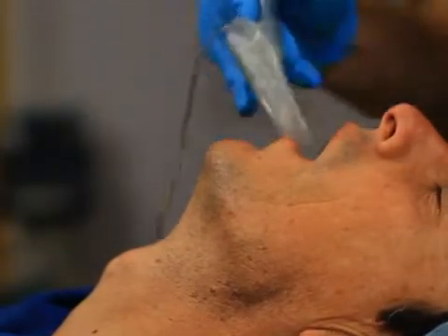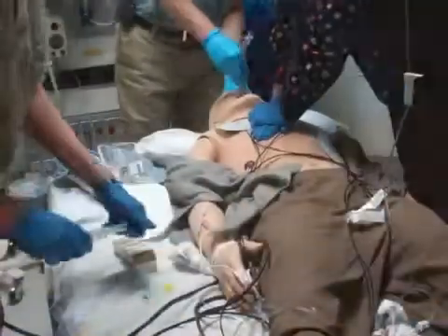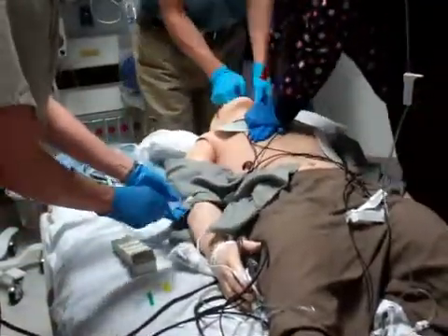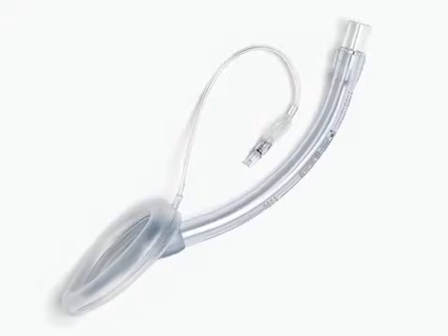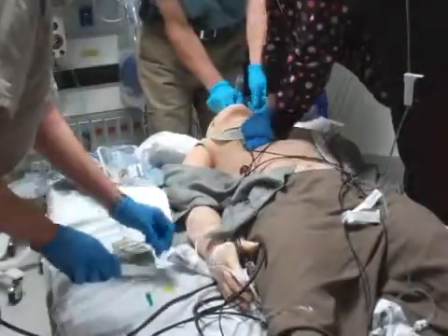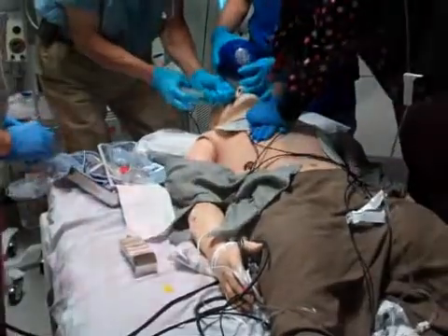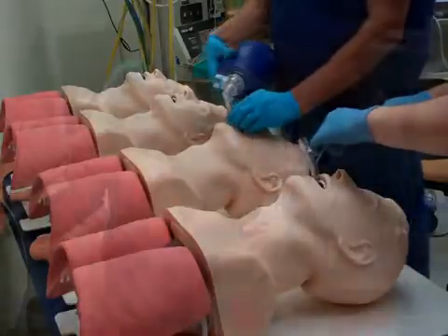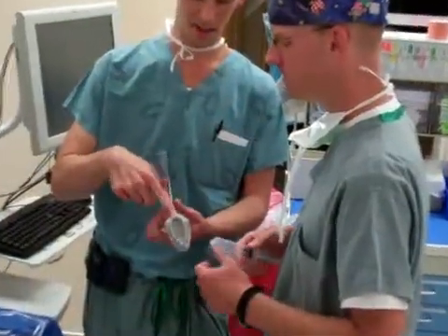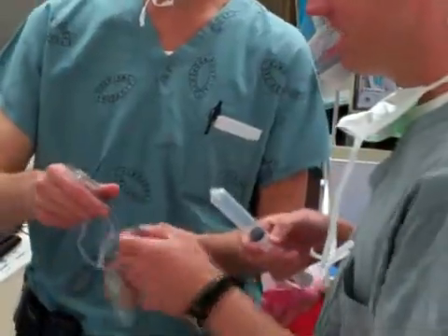This video will demonstrate the placement of the laryngeal mask airway, or LMA, as an emergency airway device in patients experiencing a cardiopulmonary arrest. The goal is to provide familiarity with and instruction in its use so that a clinician will be comfortable using this device to provide effective ventilation. Instruction beyond this video is necessary for safe and effective placement, and the clinician should seek further training from anesthesiologists or others with expertise in its use.